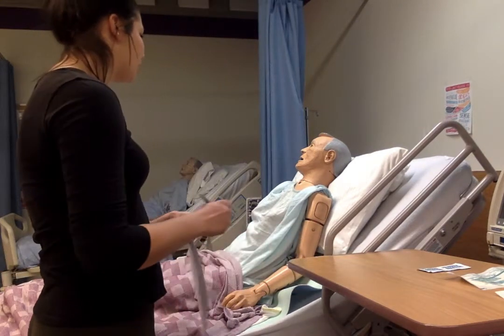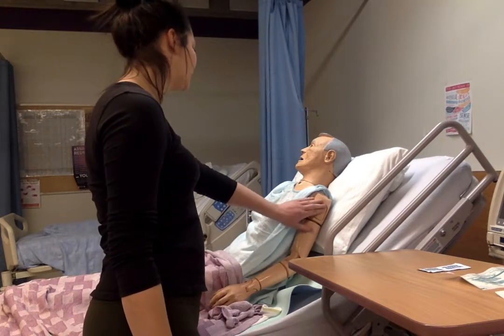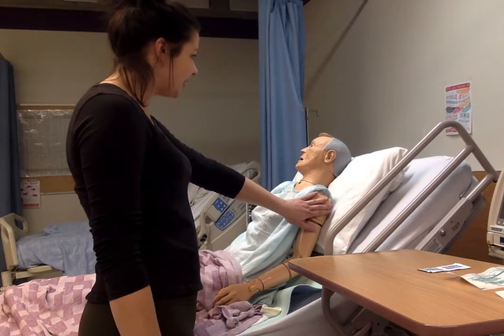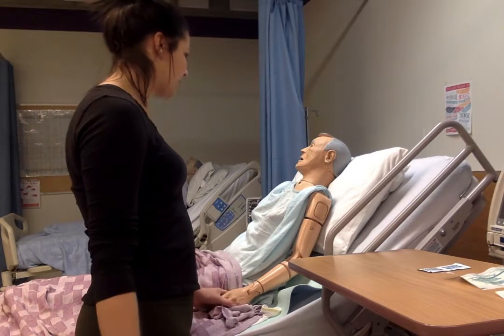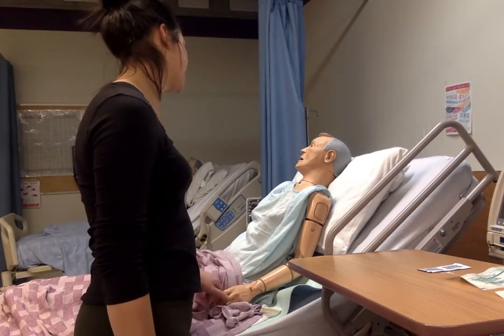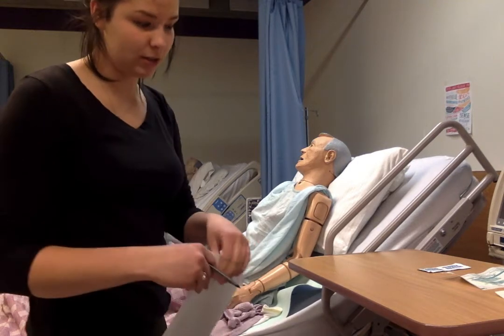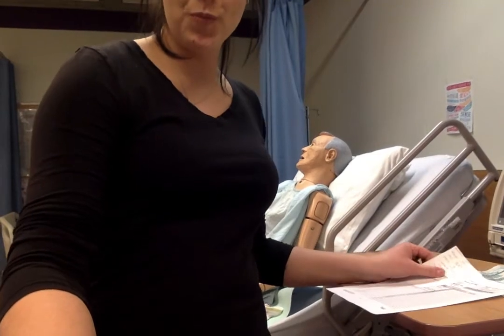So I'm just going to be going and getting that ready, and I'll come in and I'm going to insert a needle with a little catheter to hook up a temporary continuous line to give you your morphine so that we don't have to be poking you a million times to relieve your pain, okay? How does that sound? Are you okay with that? And he's okay with that, so he's compliant. We are good to do the procedure.